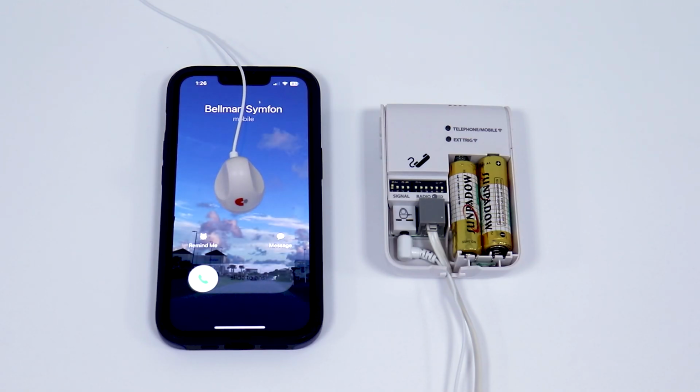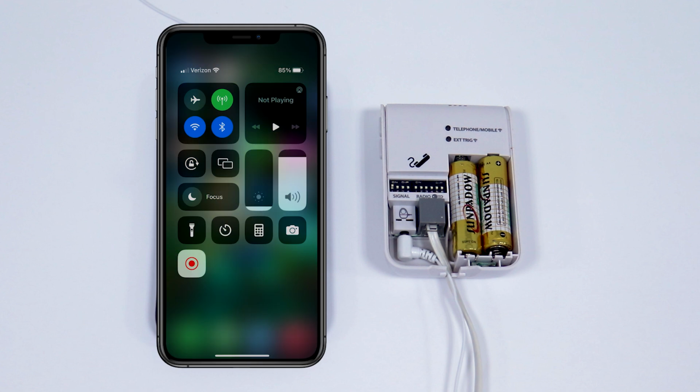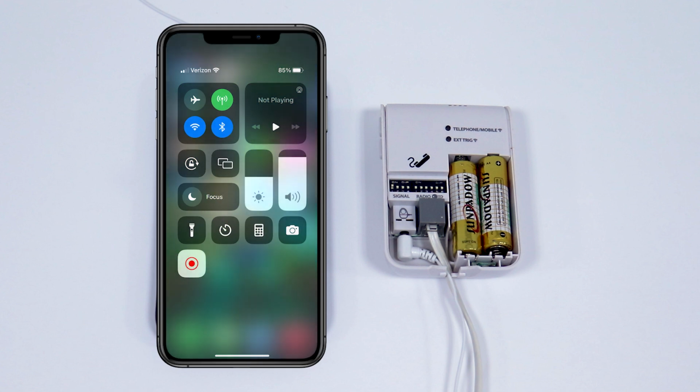In some cases, the brightness setting on the cell phone is too low for the mobile phone sensor's lens to detect it. You may need to adjust the brightness of the screen on your cell phone so the mobile phone sensor can better detect notifications for you.